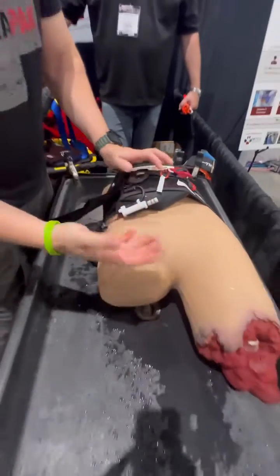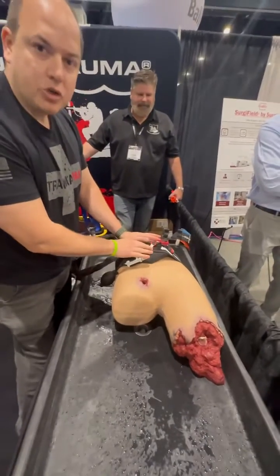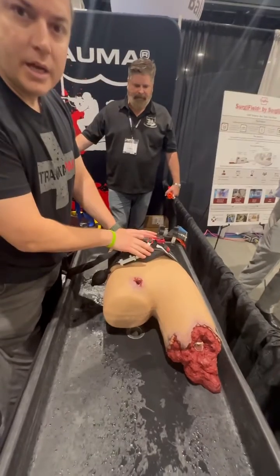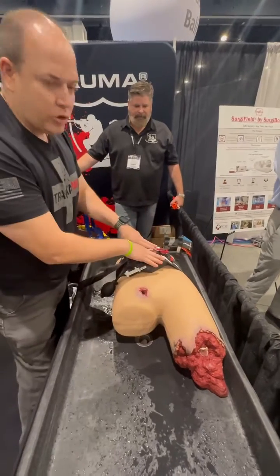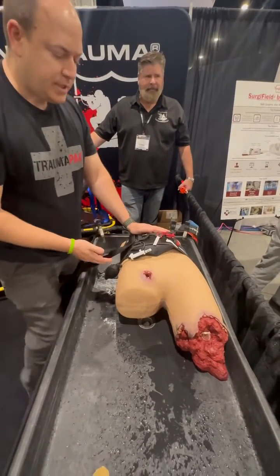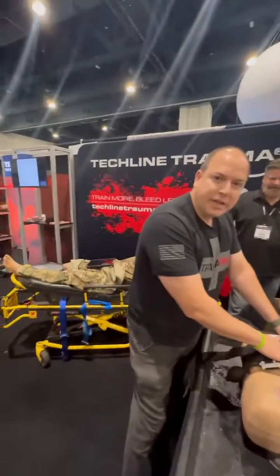We can now continue to do further patient care. This is right now the only device that will control a pelvic bleed through essentially an aortic tourniquet. This junctional tourniquet can be used in your junctional areas, aortic, and in the upper arms as well. This is the B80 task trainer from Techline, and this is the AAJTS.